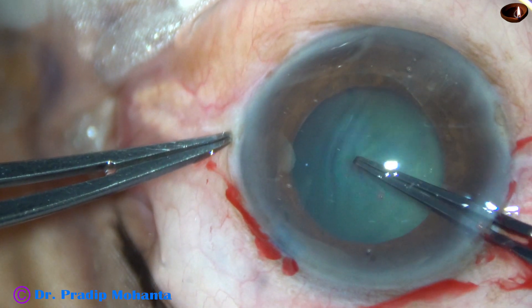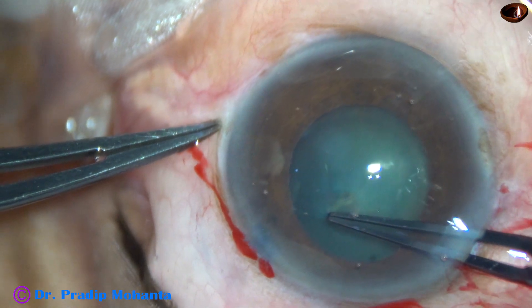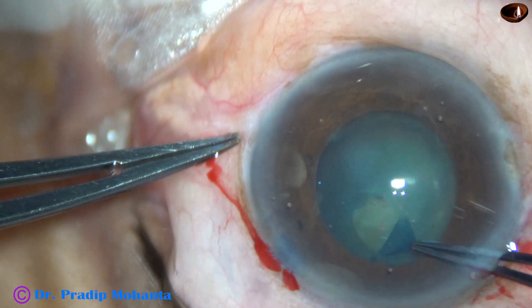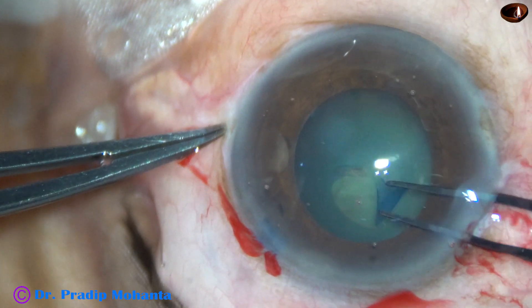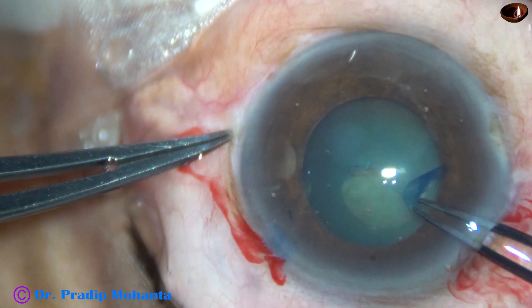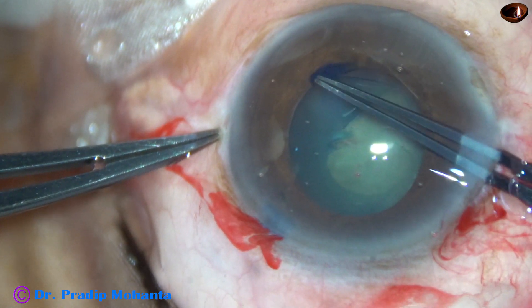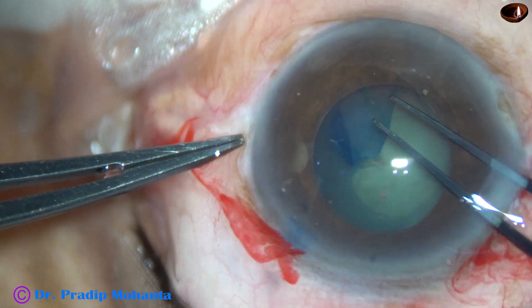And see, as I try to make a puncture to start the rhexis, the whole lens moves and there is wrinkling of the anterior capsule. So there is generalized weakness of the zonules. I have to be very cautious.